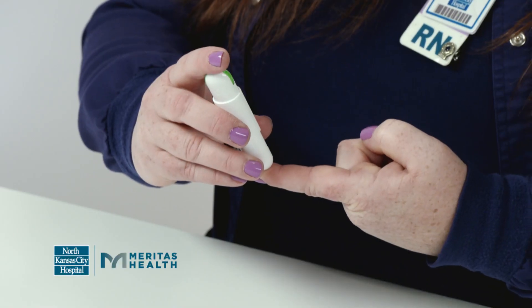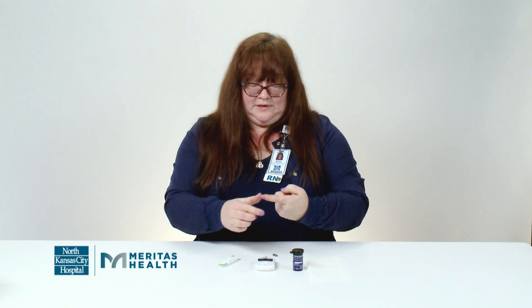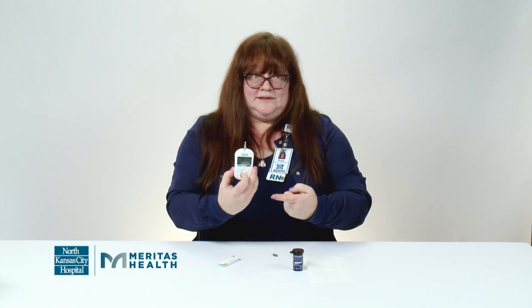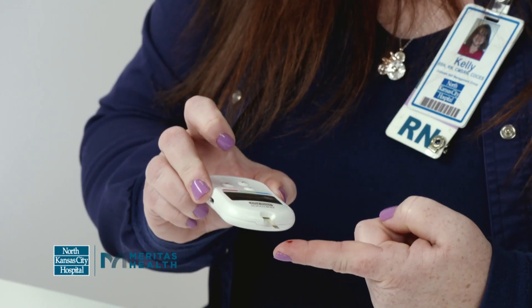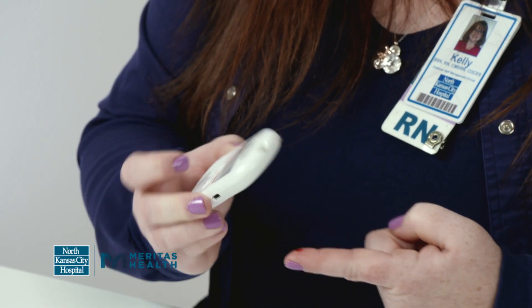You're going to hold the lancet device up against the side of your finger and press the button. Push up your blood. There's a dark line on the test strip — you are going to hold that up to your finger and it's going to suck in your blood.